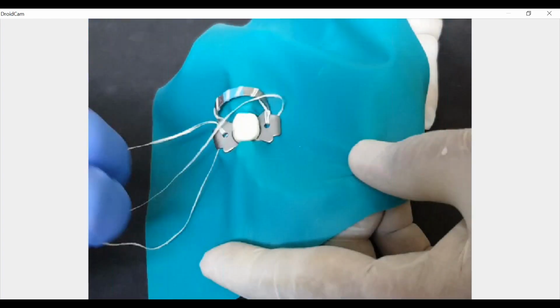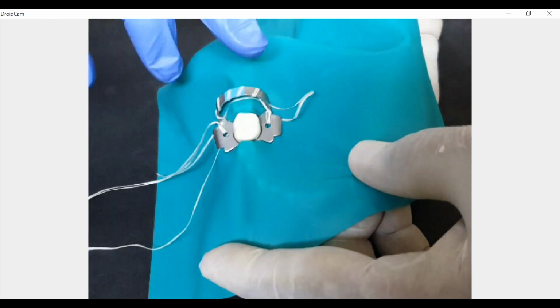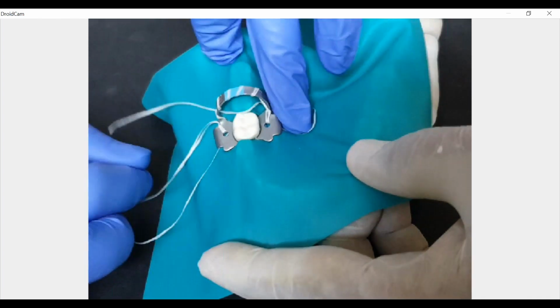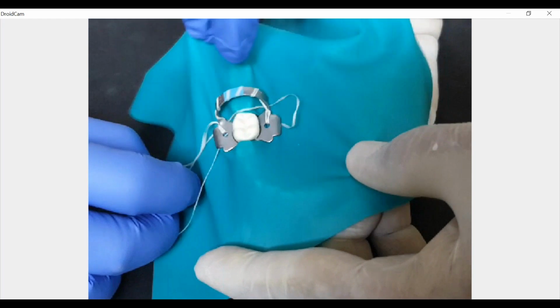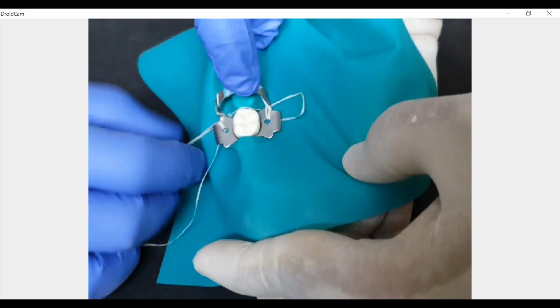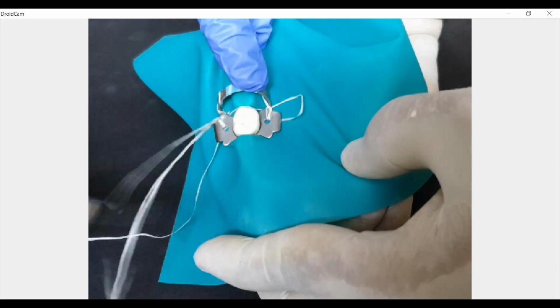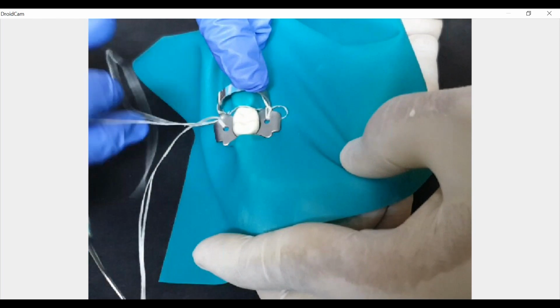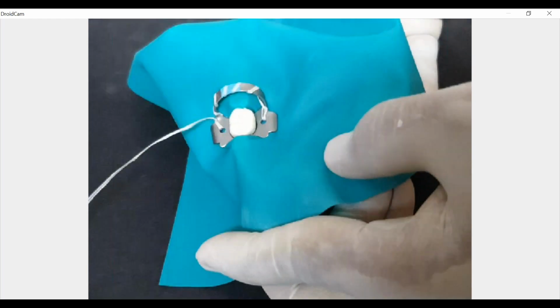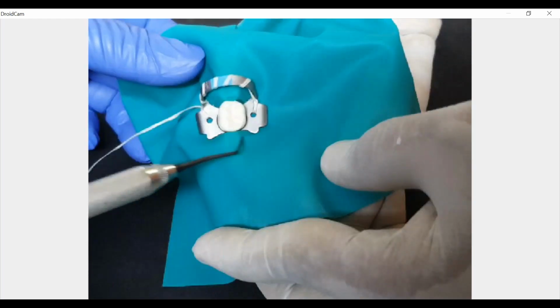See, this is what happens if I come from the front. So I'm performing it from behind. You will loop it and, as I said, you will run it on the tooth and not on the rubber dam sheet, because it will lead to bundling of the sheet. This is one thing where you will have to segregate the sheet carefully and pull it out. Sorry. Yeah, so that completes my isolation, and you can see that I have a near perfect isolation.